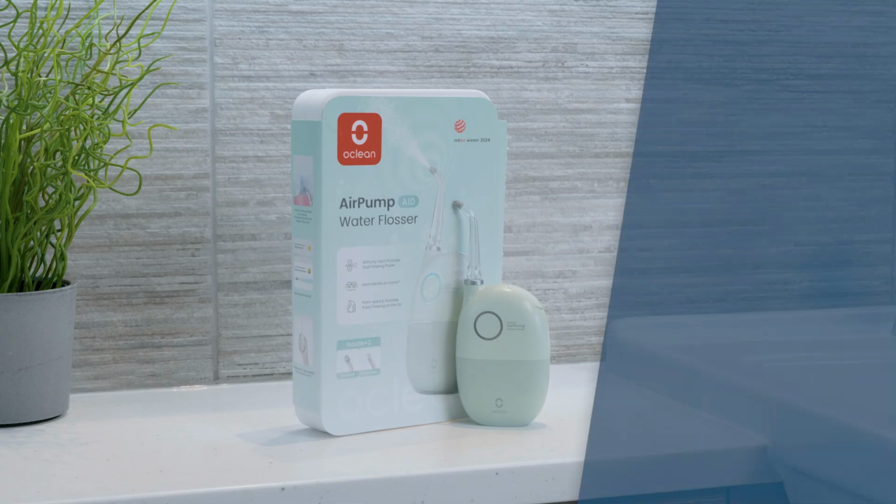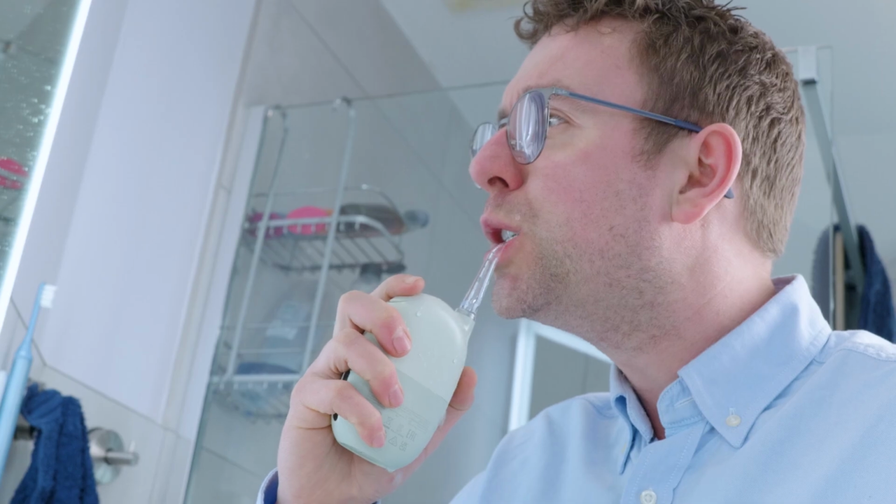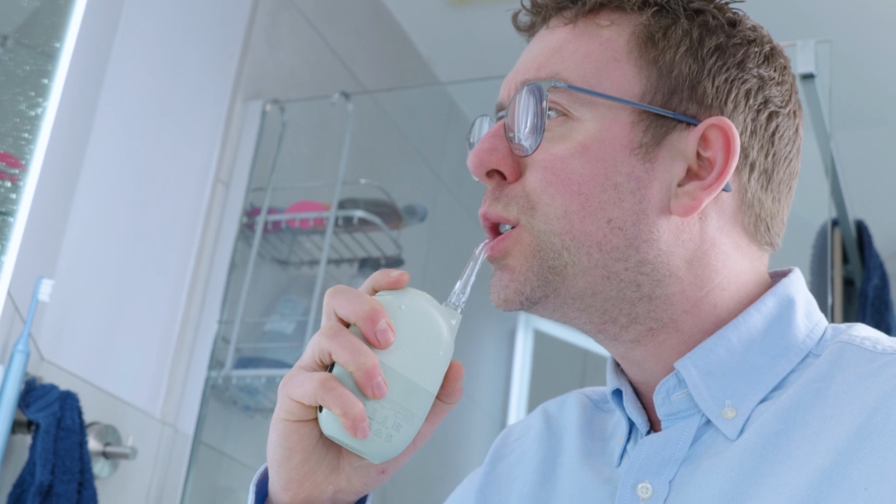In the UK, the A10 costs about £100 and includes an impressive 3-year warranty. Nozzles cost £13 for two. Oclean recommends 2 to 3 monthly replacements, but I think you can get away with every 6 months. Given the nozzles are nearly 2 times the cost of Waterpik equivalents, it's worth stretching out the usage time.